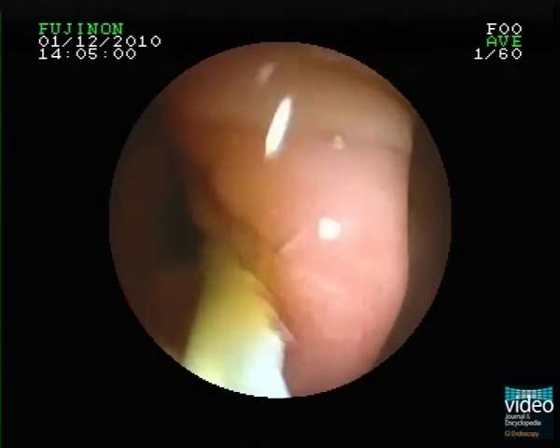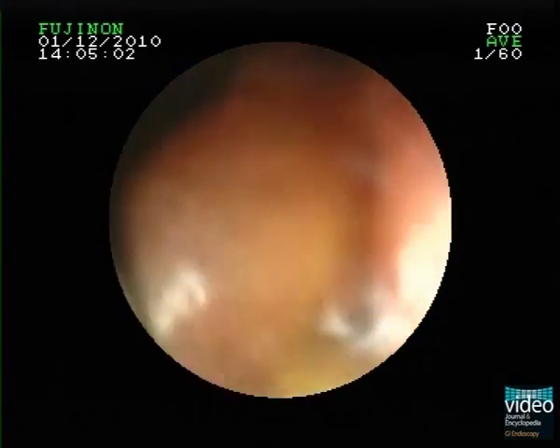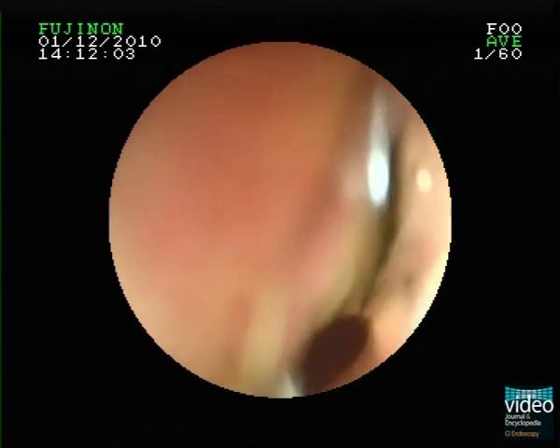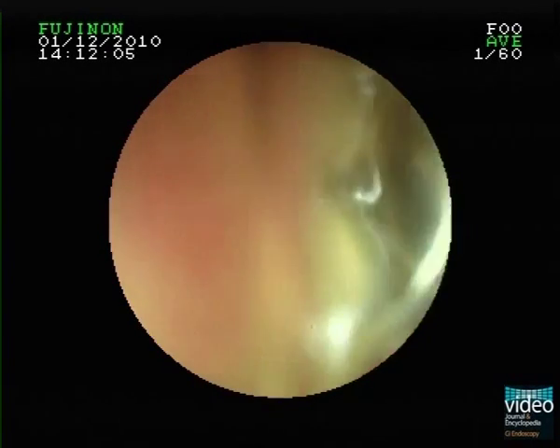Under direct visual and fluoroscopic control, we advance a balloon catheter freehand into a branch of the intrahepatic bile duct. Then the balloon is inflated to anchor it inside the duct.